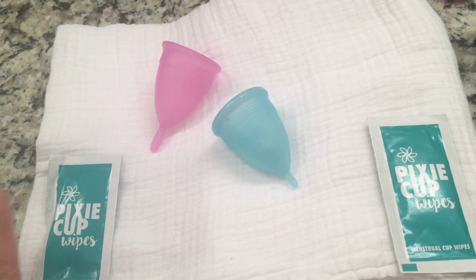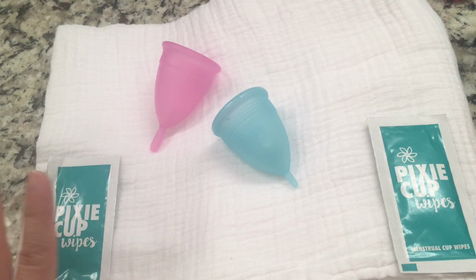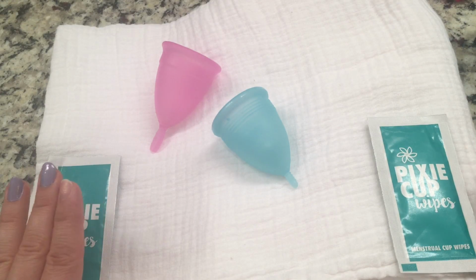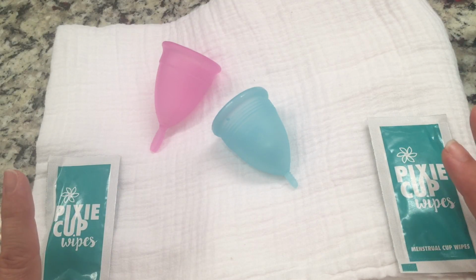So the way the different sizes work, most brands have two different sizes. And here's where it gets a little bit different if you're looking at a menstrual cup: you need to see how they define the two different sizes. Diva Cup says one is for before you have kids and one is for after you have kids. Okay. That to me was kind of like, all right.